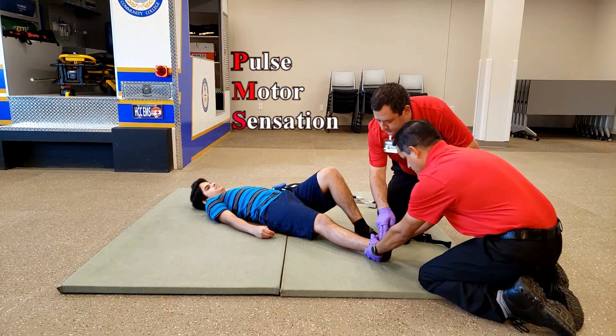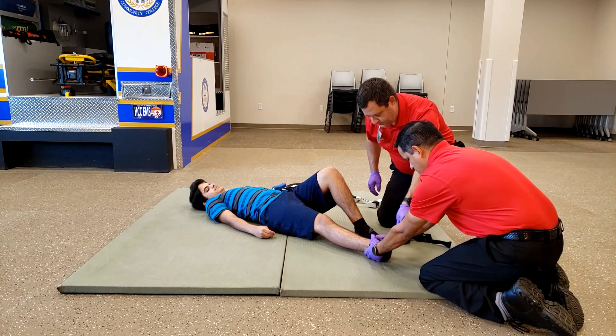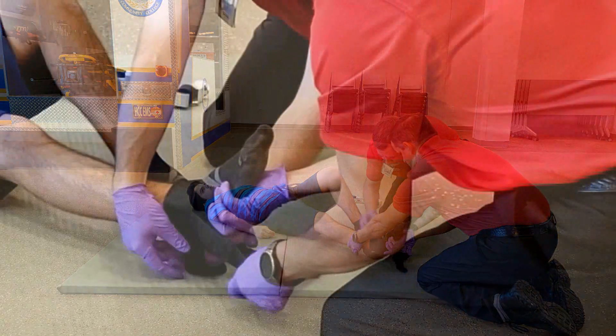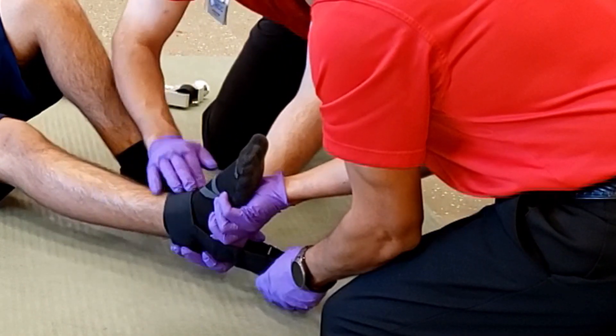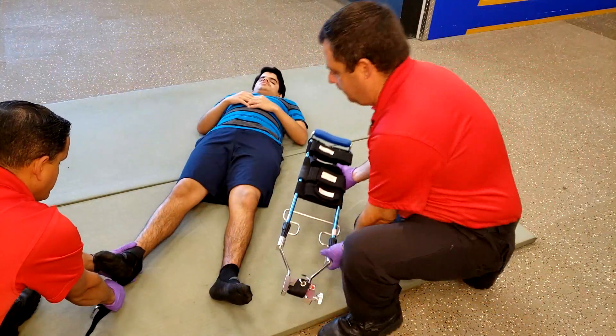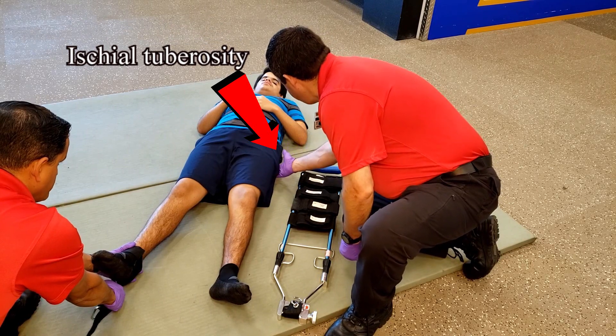Just like any other splinting method, verify the pulse, motor, and sensation distal to the injury. Then apply the ankle strap and ask your partner to continue manual traction throughout the entire process. Place the traction splint along the uninjured leg to get an accurate measurement from the ischial tuberosity all the way down to the bottom of the foot.